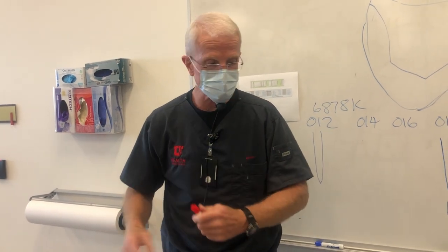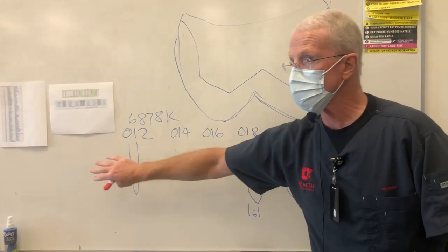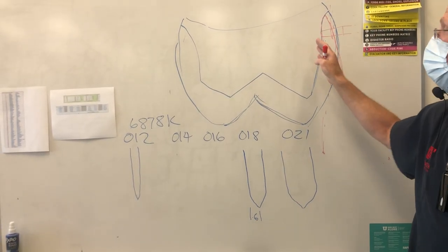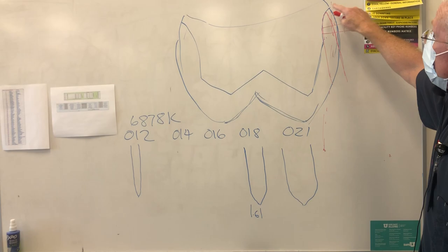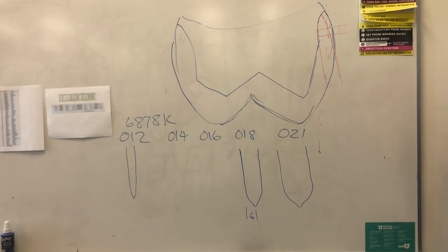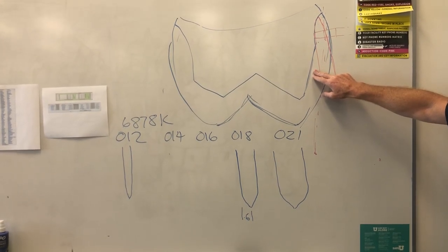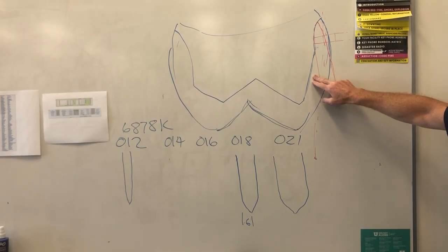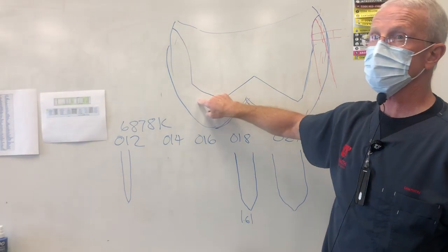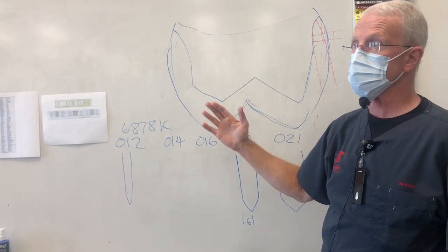So I just wanted you to kind of get a feel for the chamfer margin. Hopefully that helps. Lots of different burrs you could do it with. Use the largest one. It's going to be the most efficient at preparing that axial wall. Two-plane facial reduction, which we've introduced, you're going to be using that technique on pretty much every upper tooth preparation you'll be doing. On a lower posterior tooth, the functional cusp bevel takes care of it. It takes care of the contours on that functional cusp.